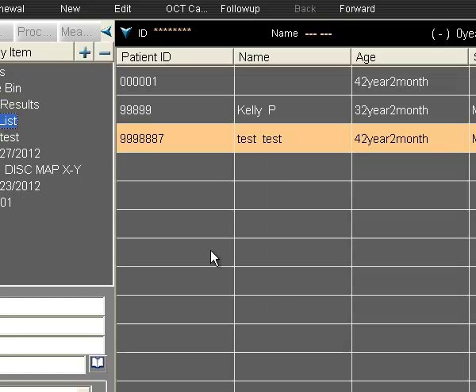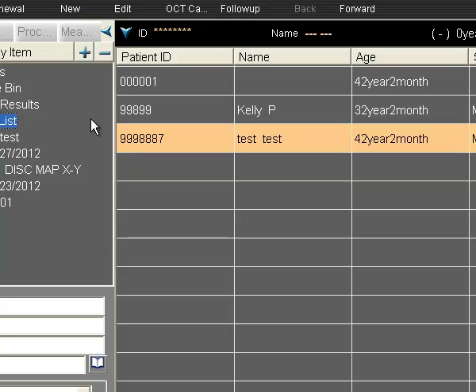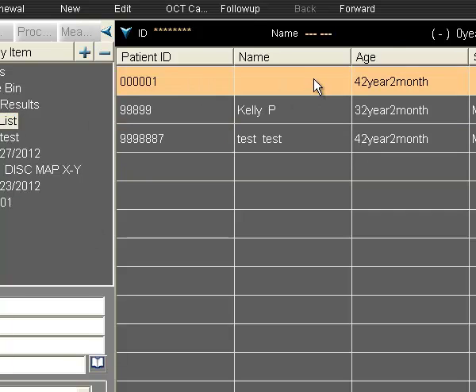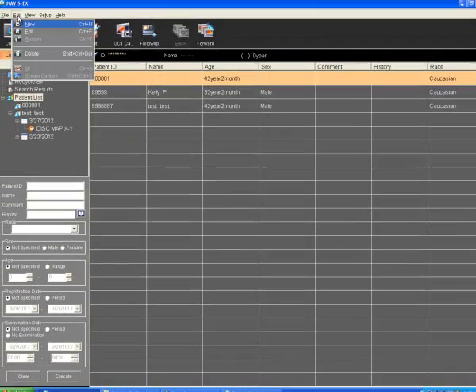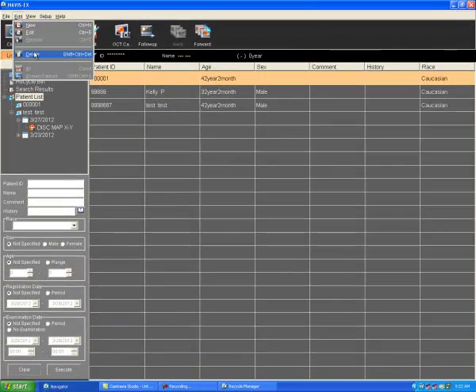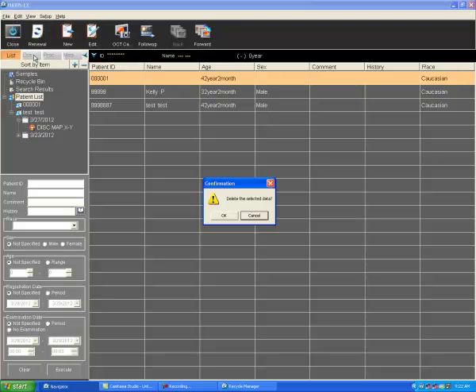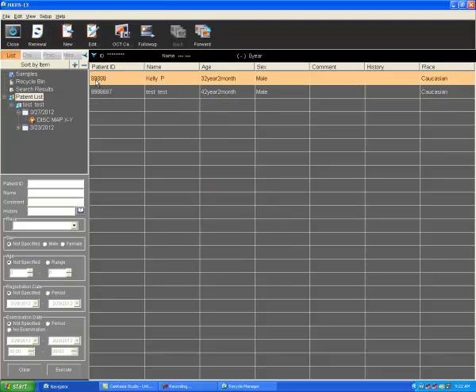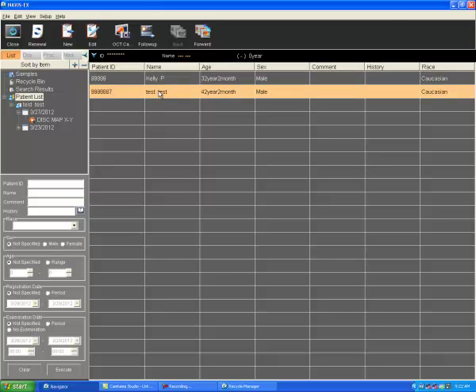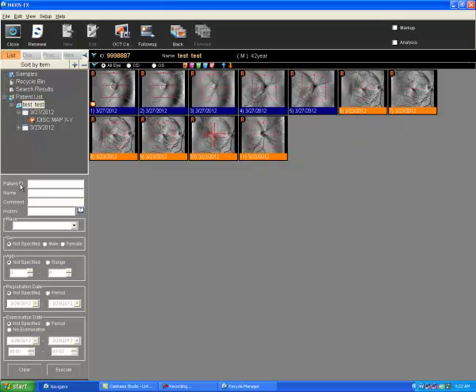To avoid confusion, I can then delete this empty patient who has no tests by selecting them, going to edit and delete. Are you sure you wish to delete the selected data? Yes. That patient has now been deleted and we are left with the records that we need, all correct.